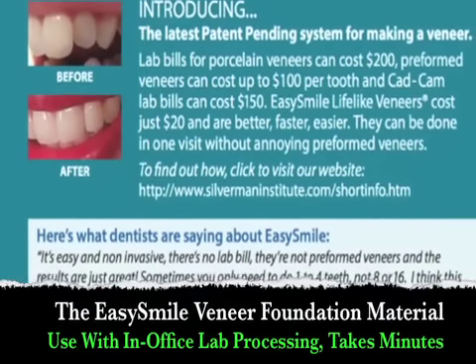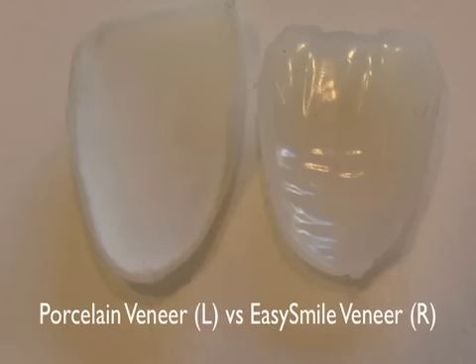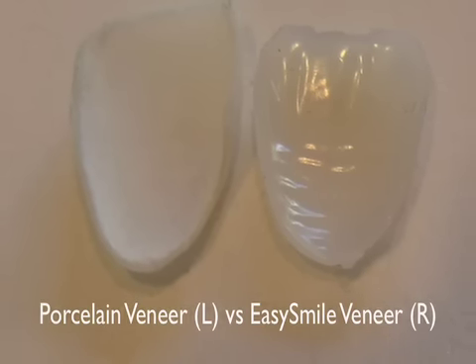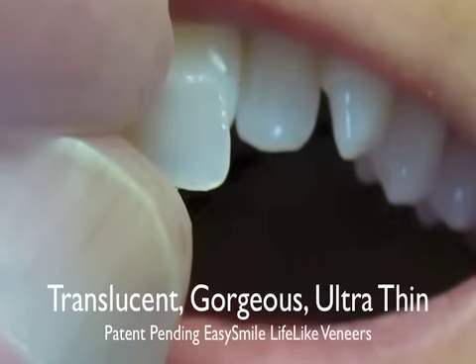The Easy Smile veneer system is meant to be faster, easier, quicker, and literally the results are so incredibly aesthetic, you're going to love the way that it looks. And you want to cure this for a full minute.